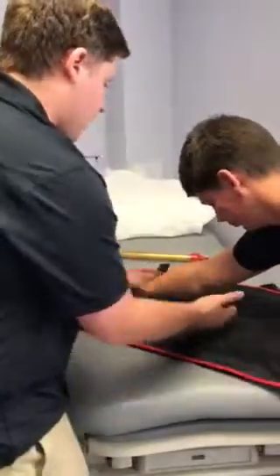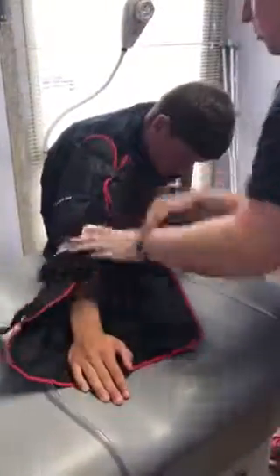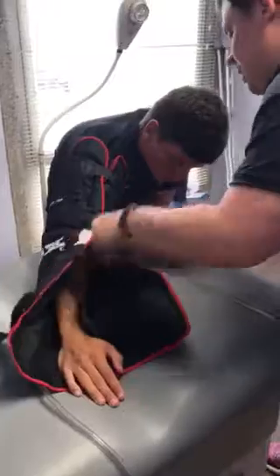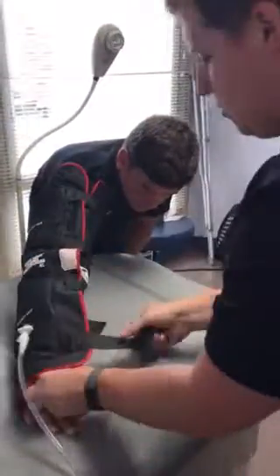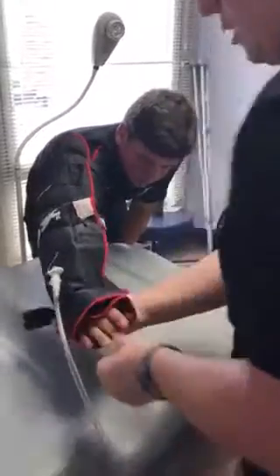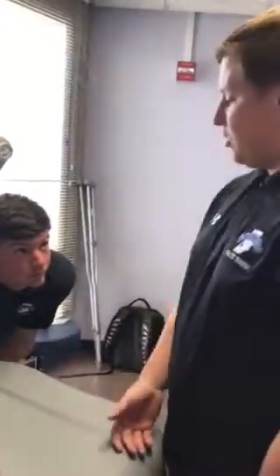So what you want to do is find his elbow, make sure the top and bottom portion of his arm are secure. You're going to take this, strap him in. You don't want to cut off circulation. You want to ask them to make sure their arm is okay. They can still feel their arm if there's circulation. Can you feel your arm?